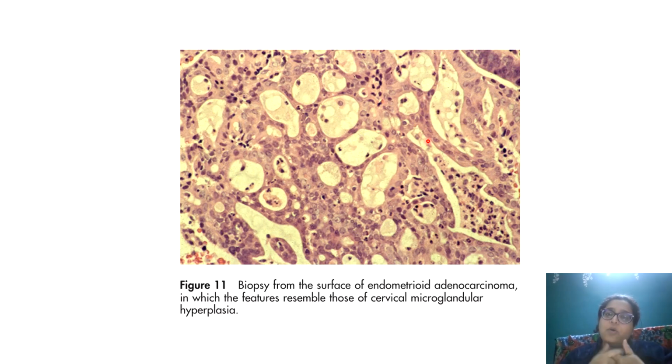So you'll ask me, then how am I to say whether it's a carcinoma or not? My approach to such cases is, when I'm in doubt, if I'm favoring a carcinoma over a benign process but I'm not sure, then I write in my report that I favor a carcinomatous process over a benign process. However, I also advise deeper sections, a more representative biopsy, or radiological correlation, whatever I need to give the surgeon a direction. I don't leave it as a mere description or say I cannot conclude. There is something that you are concluding, you are just not sure.